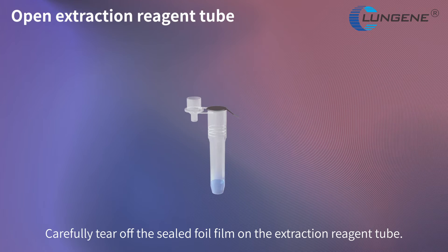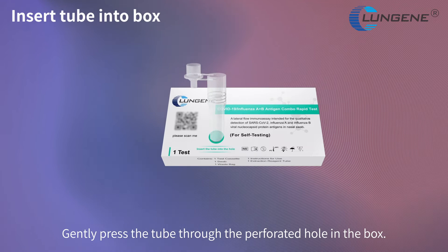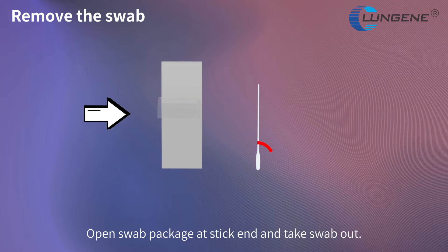Carefully tear off the sealed foil film on the extraction reagent tube. Gently press the tube through the perforated hole in the box. Open the swab package at its thick end and take the swab out.